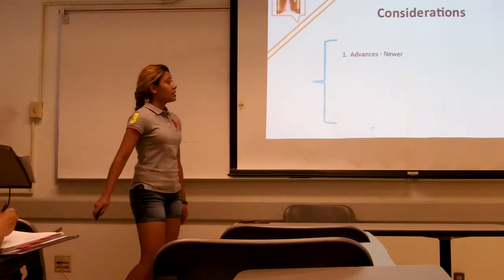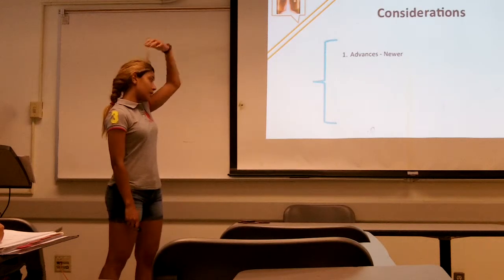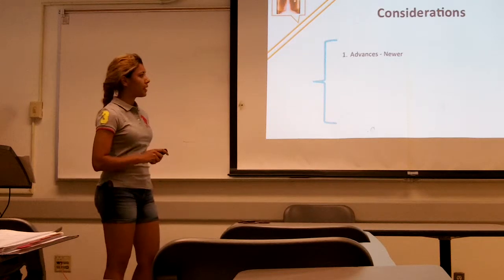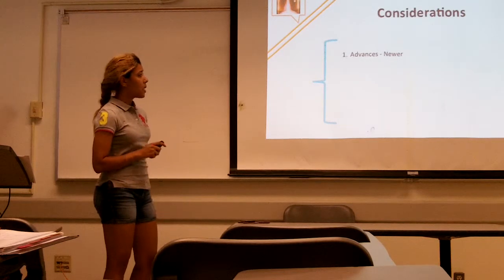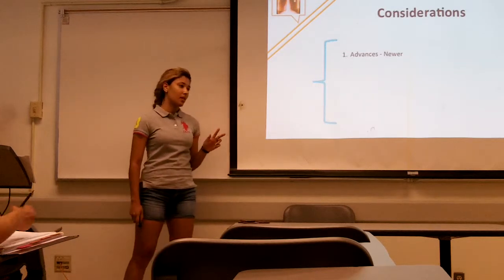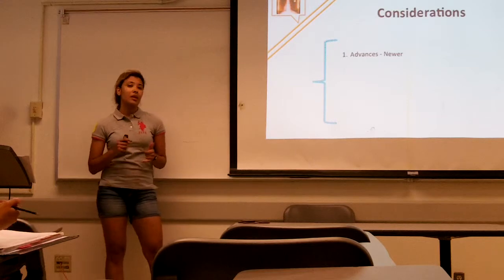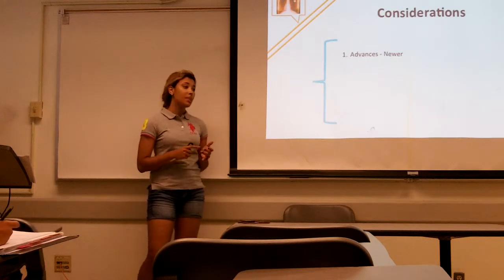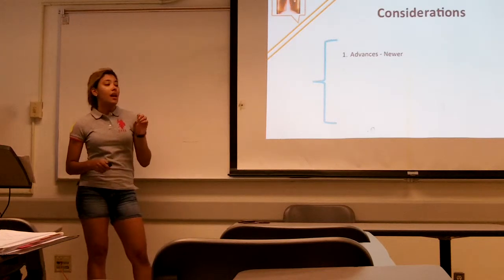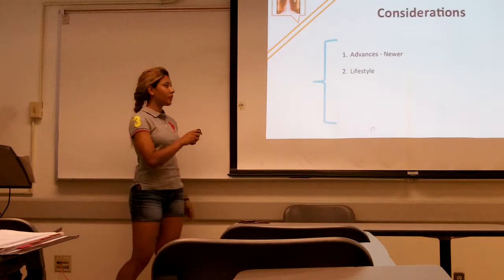Some considerations are very important, especially with these newer pacemakers, the advances, because they can do important things. The new pacemaker can measure the breathing rate and blood temperature. Because of this, they can slow down the heart, unlike the other pacemakers.